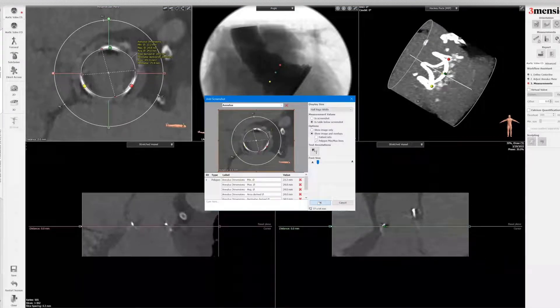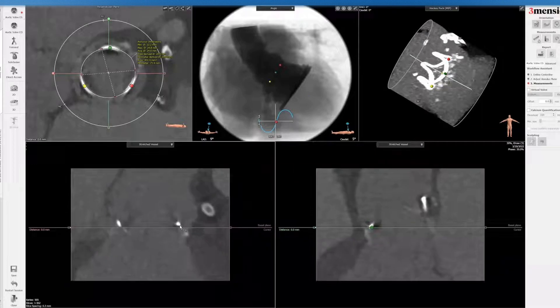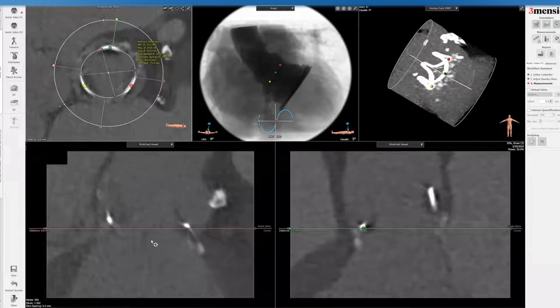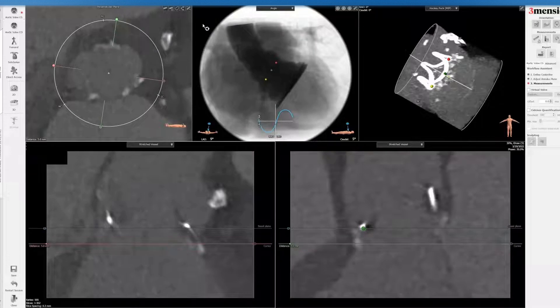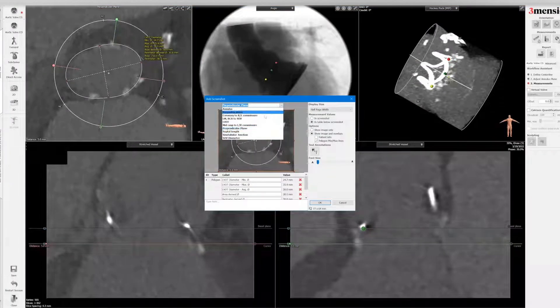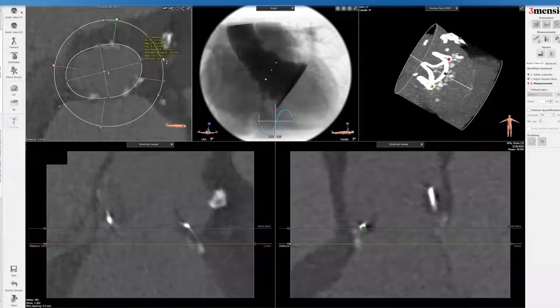You can click that as the annular diameter and put it on your report. I'm going to crop this to enlarge the area and do the same thing with the open circle going towards the left main — you can see the left main there. Then go down to the LVOT. The LVOT in this particular case is very large. We're less concerned about this in a standard surgical valve, but in a stentless valve you'll have to measure this to size it accordingly. The LVOT diameter here is less relevant, but it's still important.